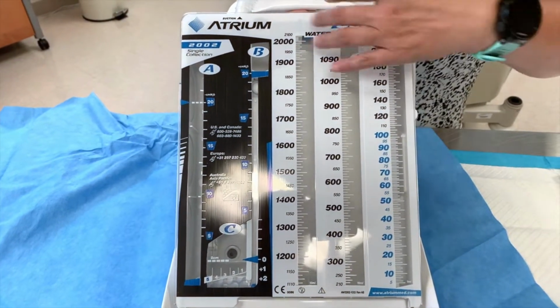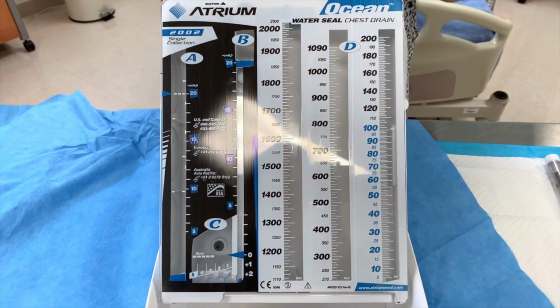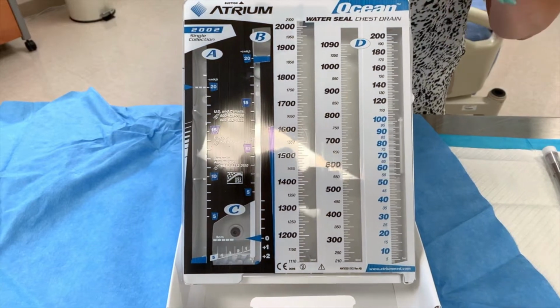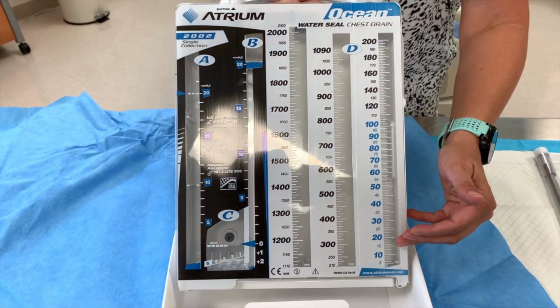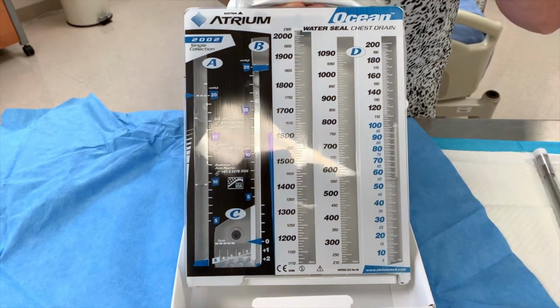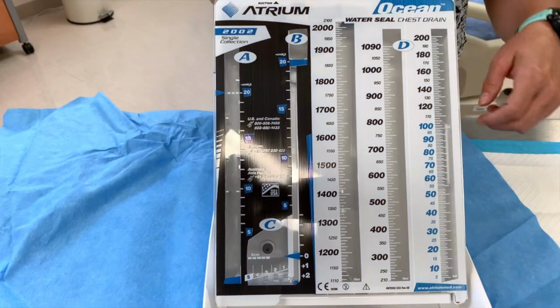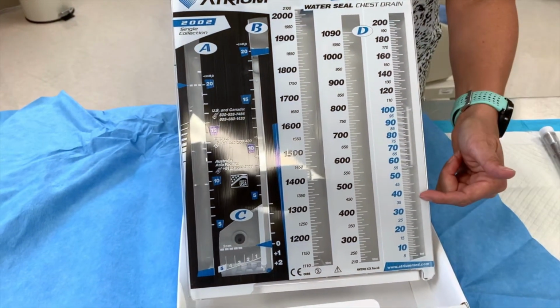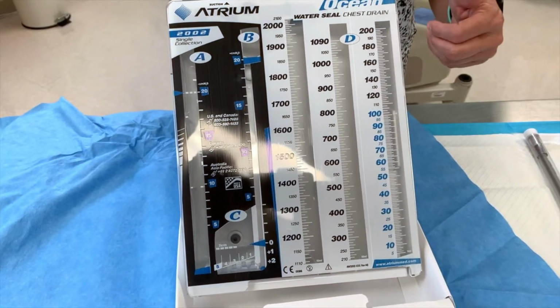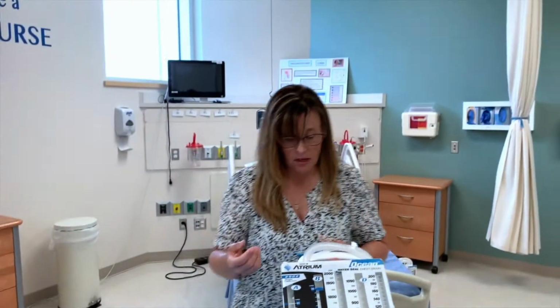The last chamber that you're going to look at is this big chamber over here. This is the collection chamber. This is where you will be monitoring your output from your patient. And remember, if it ever goes above 100 mLs over a 1 hour period, you're calling your doctor right away. Continue to look at the consistency and the color, because you want to monitor for patients who may be having active hemorrhage, things like that.